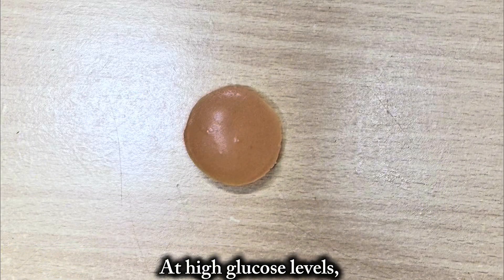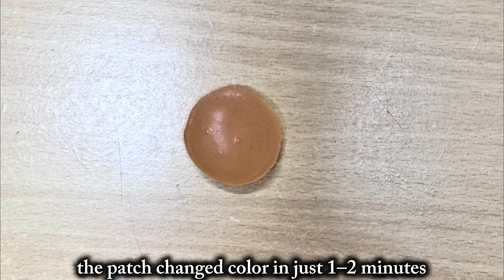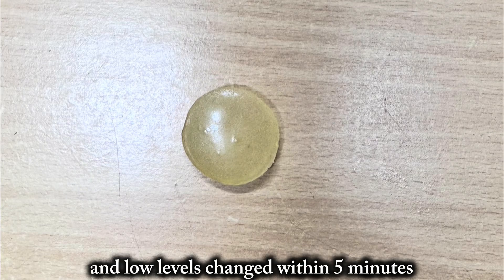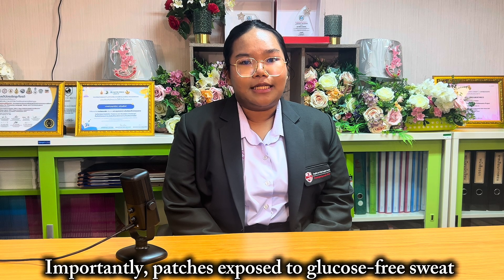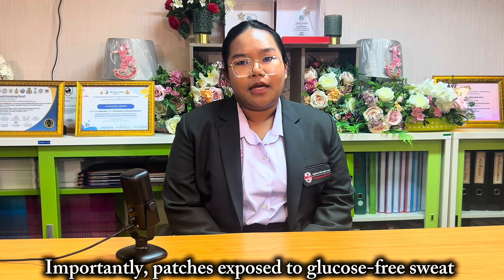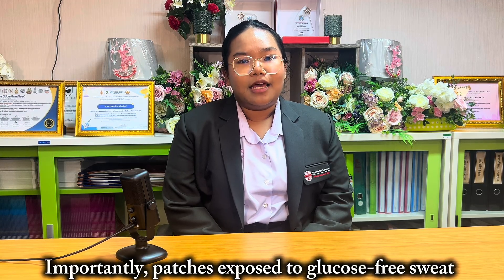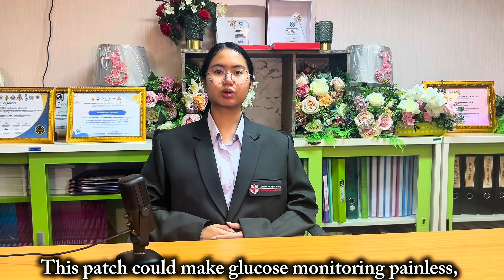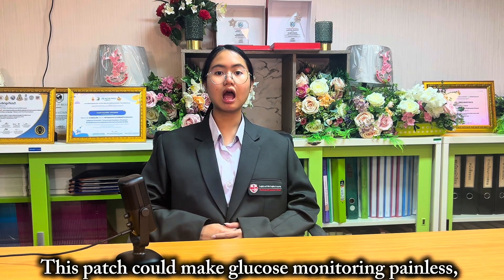At high glucose levels, the patch changed color in just 1–2 minutes. Medium levels took around 3 minutes, and low levels changed within 5 minutes. Importantly, patches exposed to glucose-free sweat showed no change, proving specificity.